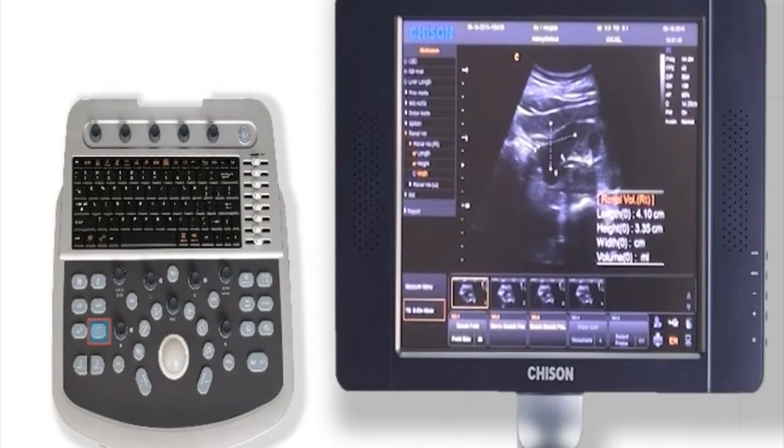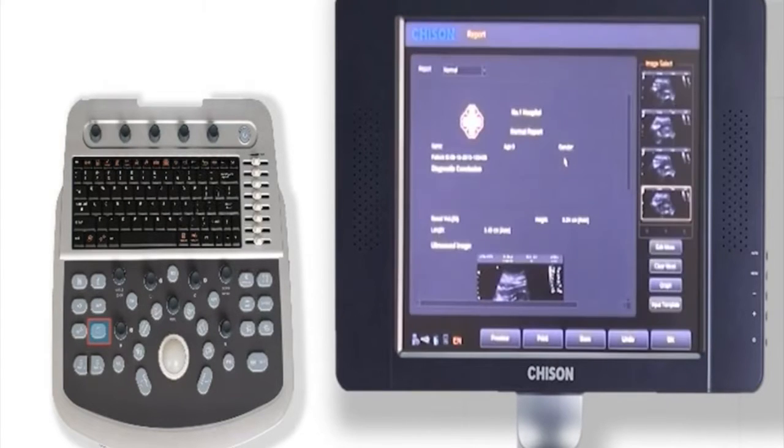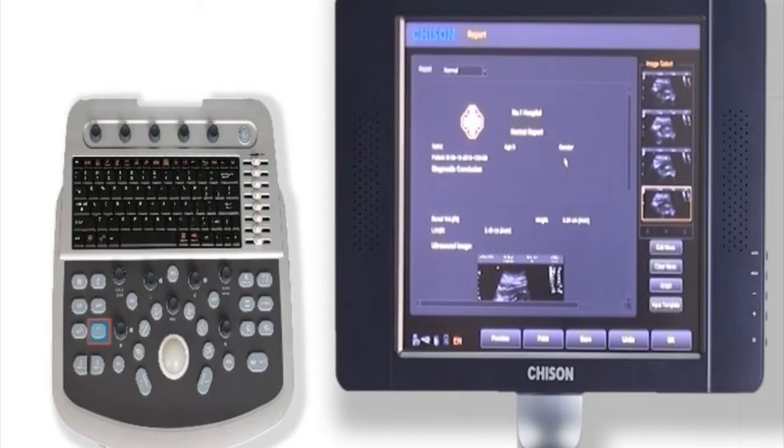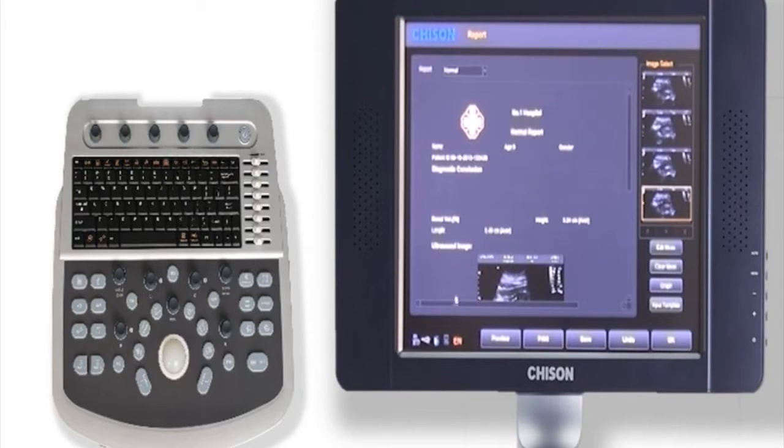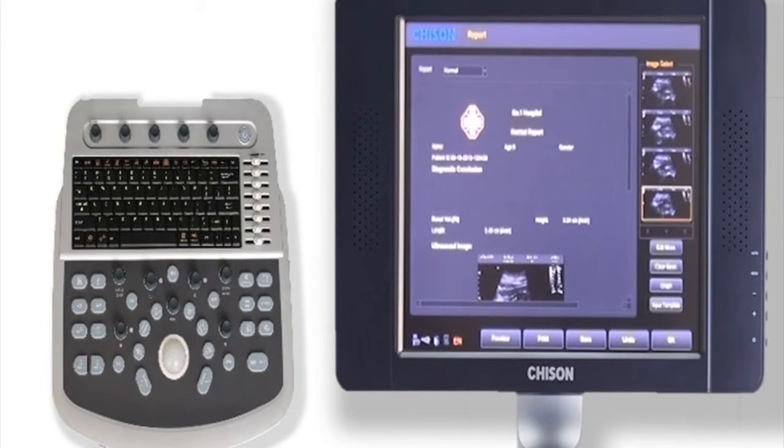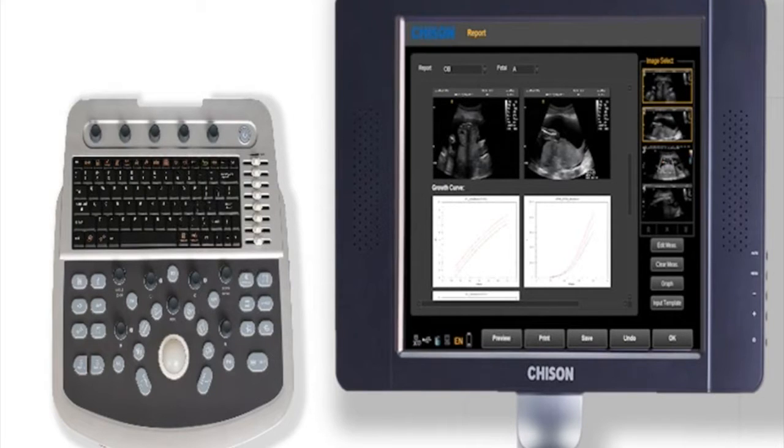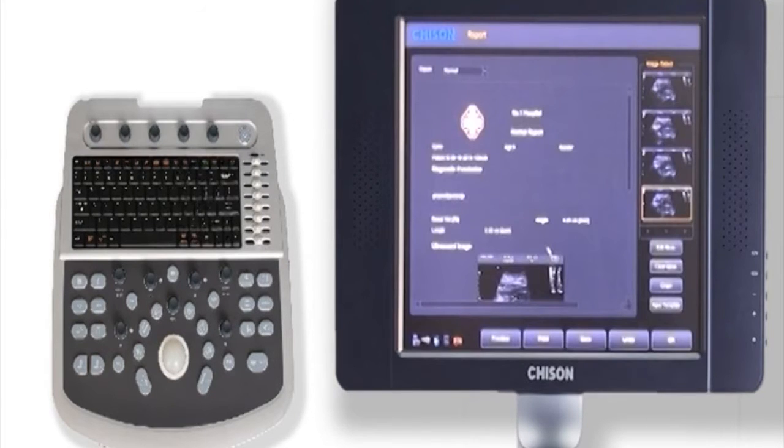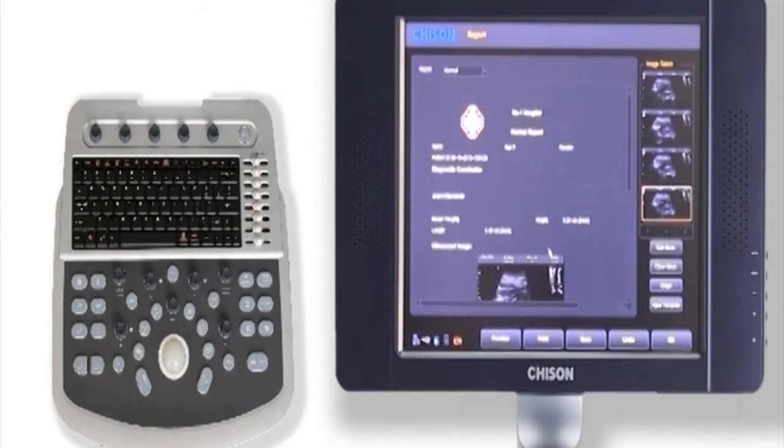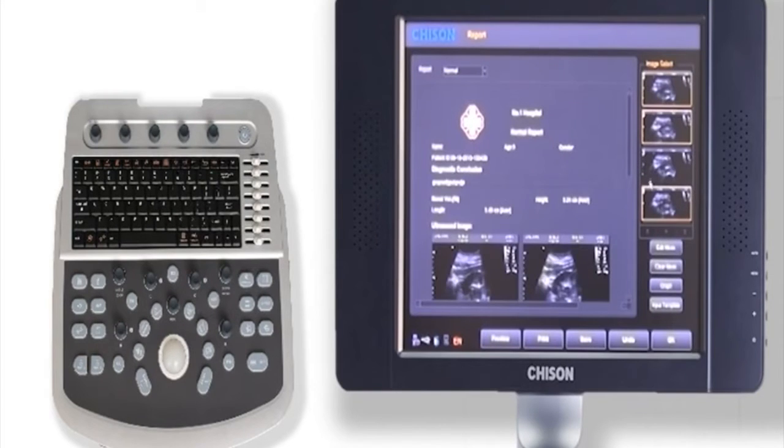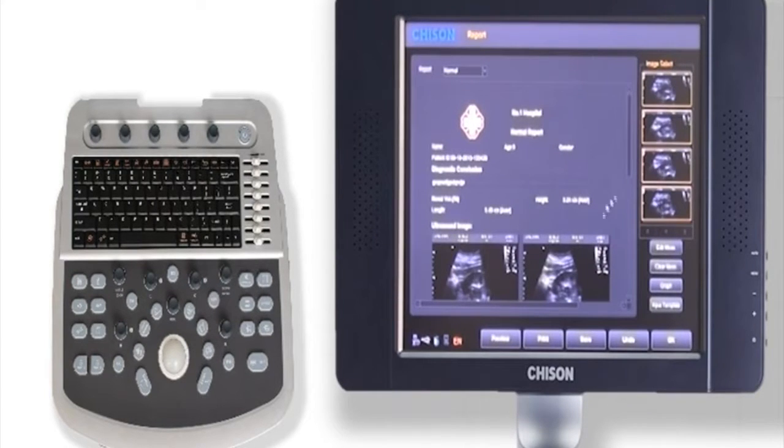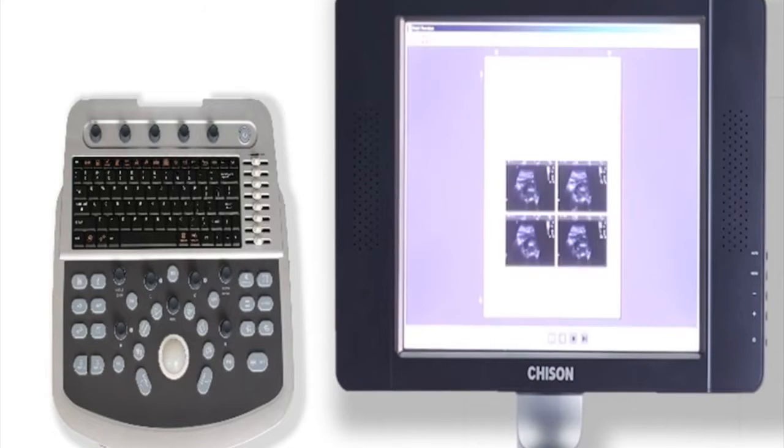Press the report key. The system will show us a report. We can find the calculation results also shown on the report. Here we can input diagnose conclusion and add images we saved. Then we can preview to see what the report looks like if we print it.